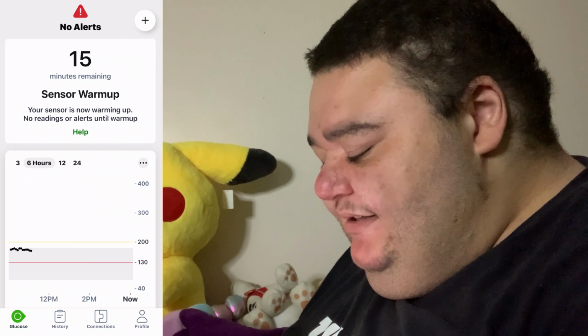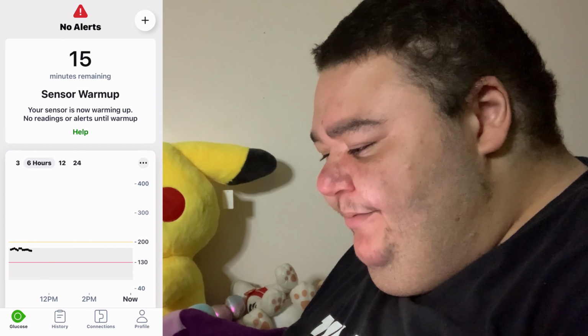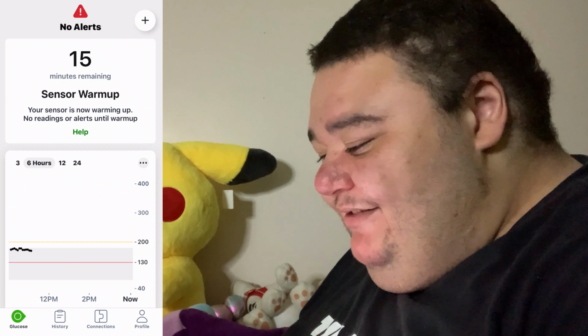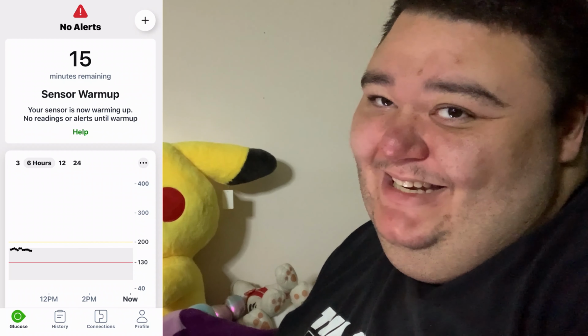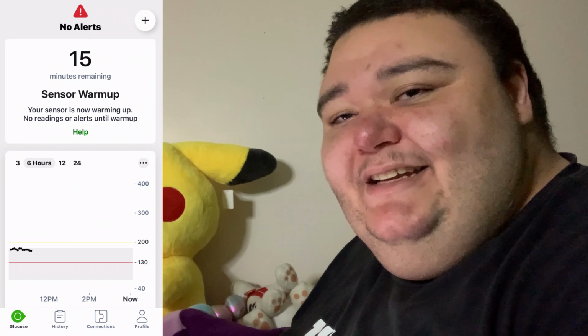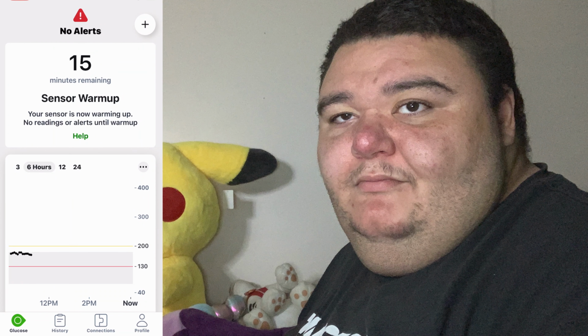Now it says 15 minutes. Sensor paired. Your sensor is now warming up, and then you wait for the 15 minutes. It was 17 when I had the receiver, but now it's 15. I'm going to be back and hopefully it's completed after all the warm-up, and hopefully everything will be smooth sailing there. We'll be right back.